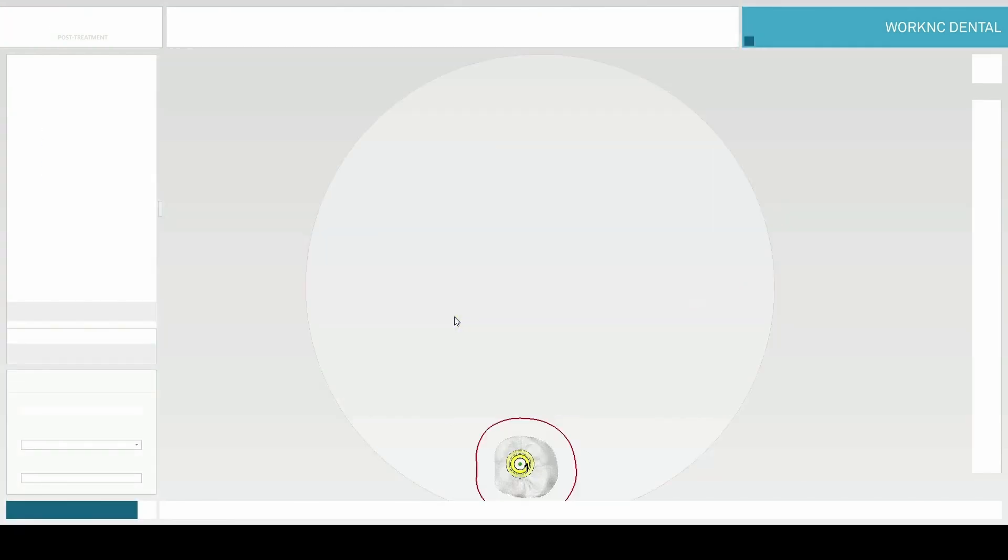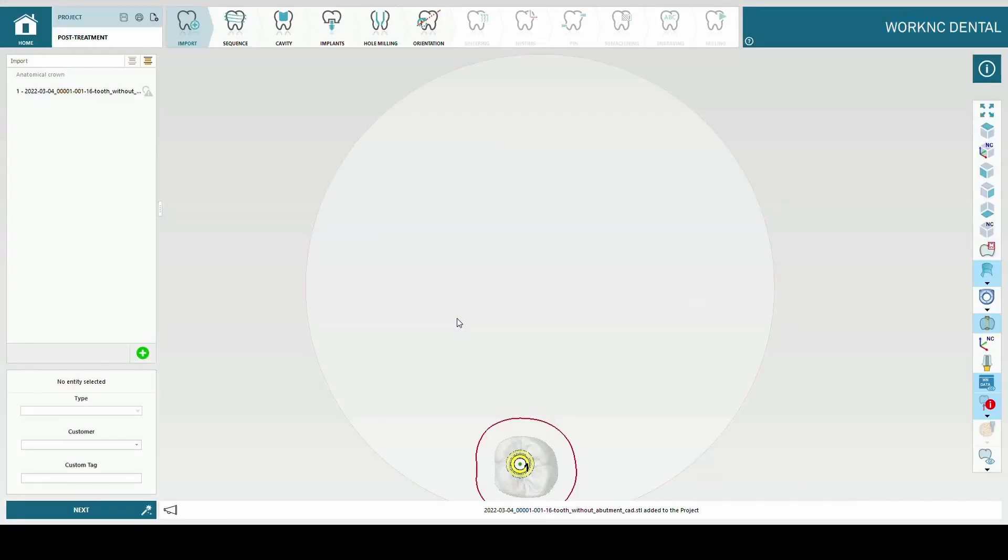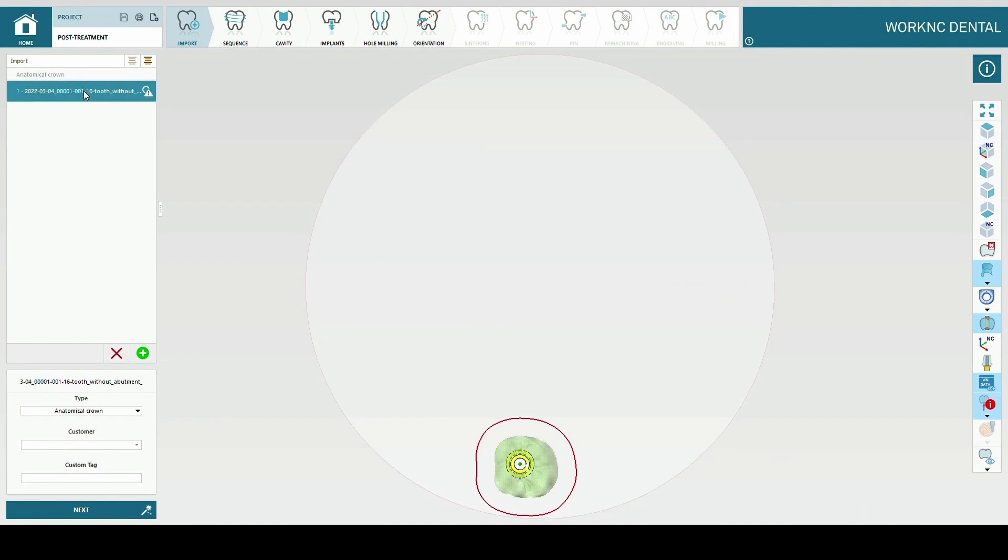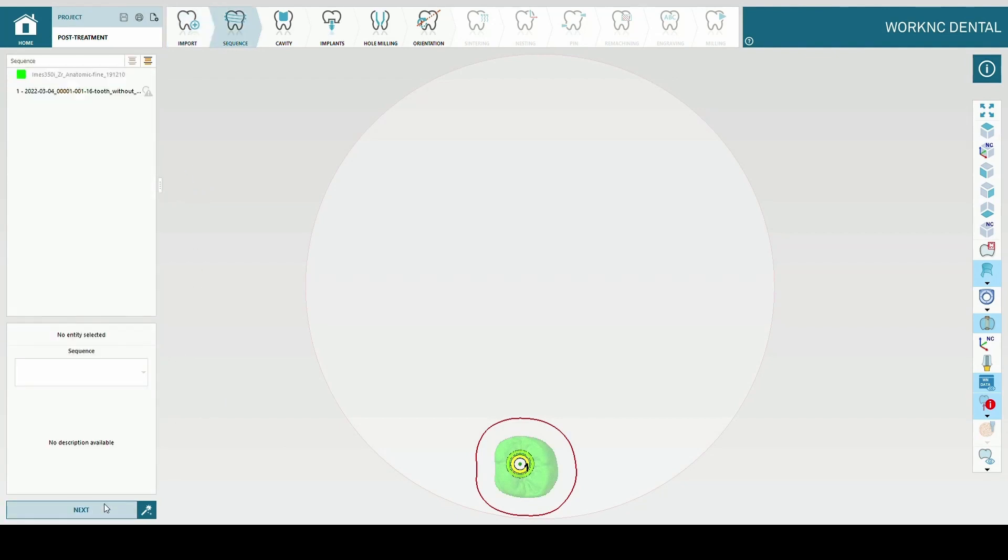The software should detect, according to the construction info, the corresponding implant geometry file, yellow model. Click next.